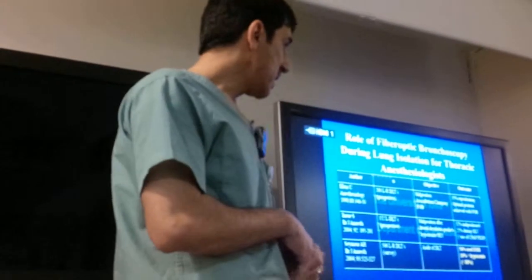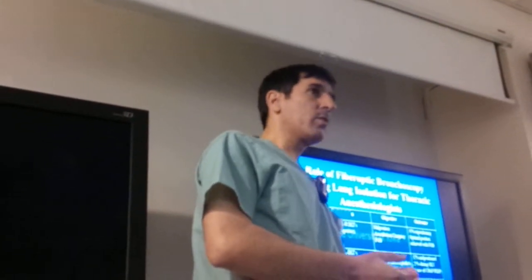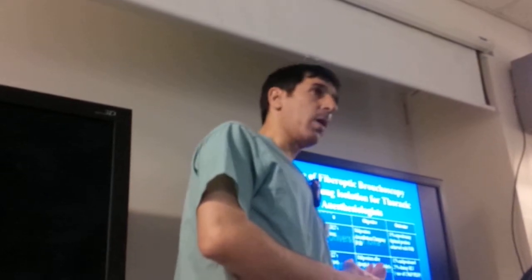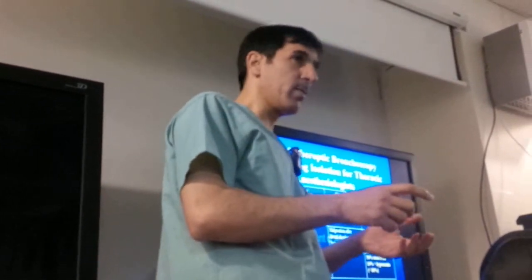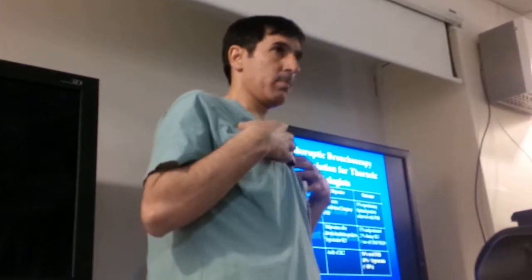Now, many studies have been made for anesthetists who do not do regular anesthesia lists, and usually before the introduction of the fiberoptic, when we were using the double lumen tube, the rubber one, I don't know if anybody remembers it, we didn't have a bronchoscope, we just auscultated.